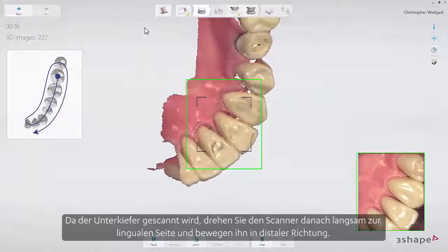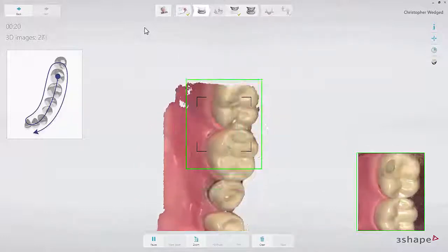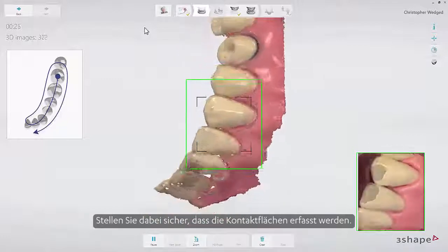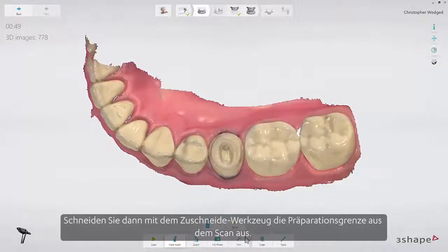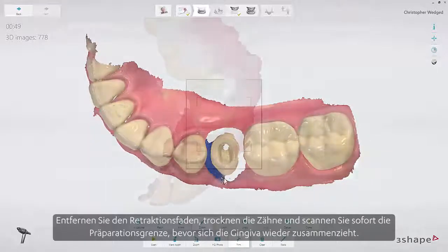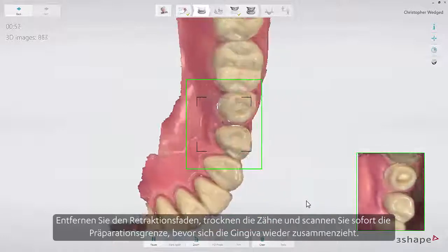Then, as it is the lower arch, slowly roll to the lingual side and move the scanner in the distal direction. Finally, slowly roll over the last molar and scan the buccal side. Make sure to cover the contacts. Then trim away the margin in the scan using the trim tool. Remove the retraction cord, dry the teeth, and scan the margin immediately before the gingiva collapses.